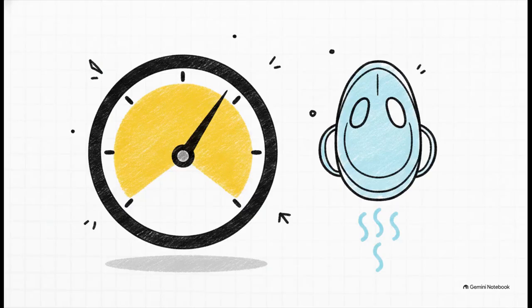Now, a golden rule for oxygen, or FiO2: keep it to the absolute minimum. If a baby is satting beautifully at 95% on room air, so 21%, that is fantastic. For preterm babies, we have to be super strict, keeping their SpO2 strictly between 90 and 94%. If they creep above 94, no questions asked. You've got to turn that oxygen down.